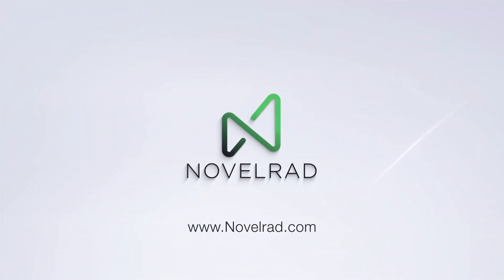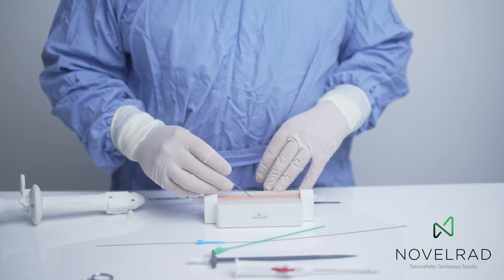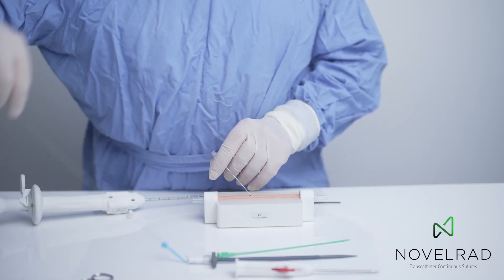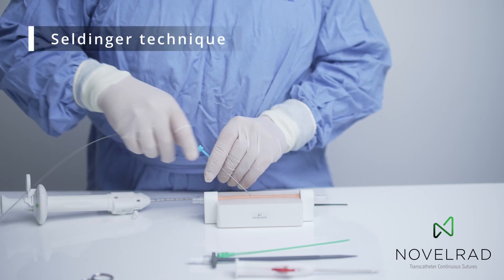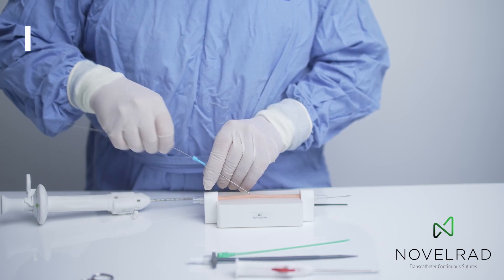Hi, this is a video which demonstrates how we use the Novelrad device on a model. There is an artery which we've printed at Novelrad, which is 6 mm, and it's punctured by a standard Seldinger technique, and a guide wire is advanced into the vessel.